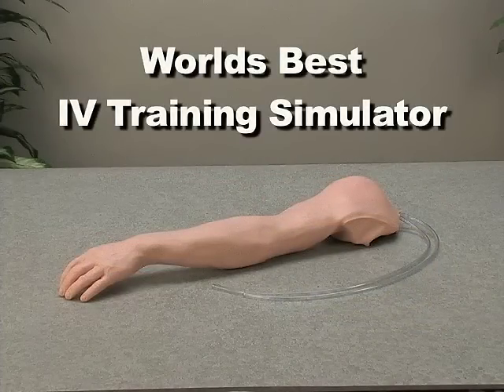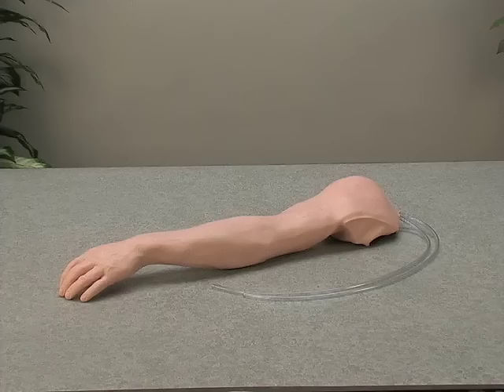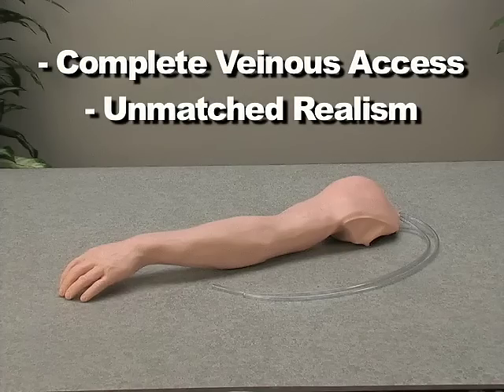The NASCO Lifeform Advanced Venipuncture and Injection Arm is the best IV Trainer in the world and one of NASCO's top selling products. The arm's combination of complete venous access and unmatched realism makes it an amazing tool in your training curriculum.